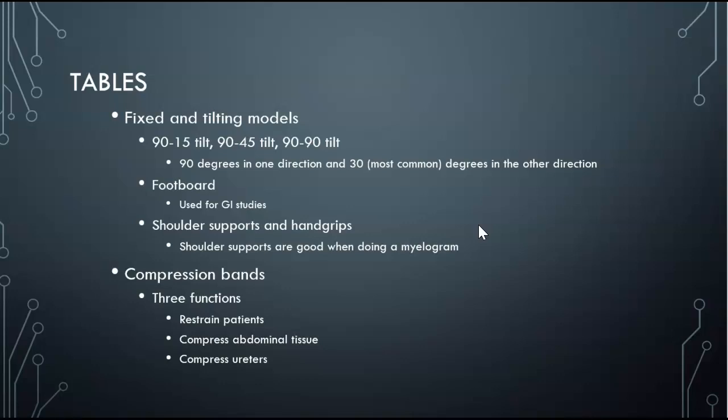Most of the tables have a footboard, and we put the footboard on when we're doing any kind of GI study where we're going to have to stand the patient up. A lot of times I will also use the footboard in an X-ray room when I have a frail person or someone who's really weak and they came in a wheelchair and I can't slide them over from gurney to table. I'll put the footboard on, stand the table up, lower it all the way down, then stand the person up on the footboard and then lay the whole table down. Okay, so that's another way for you to use that footboard to your advantage.